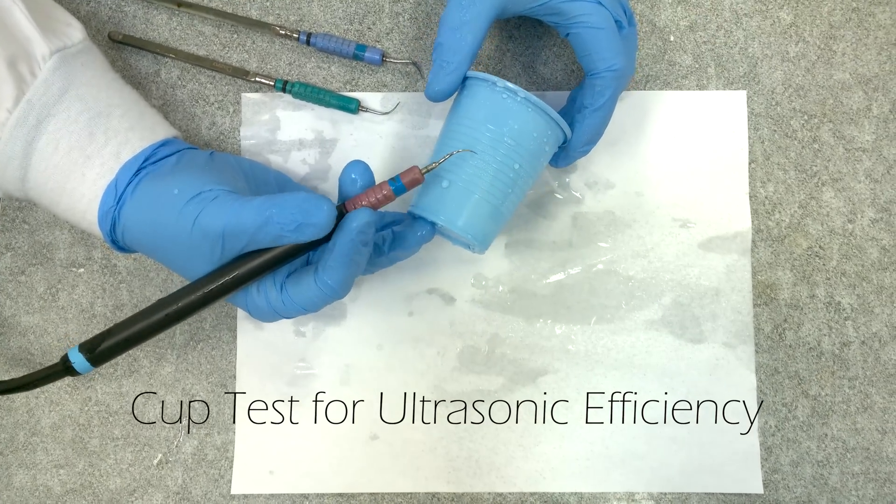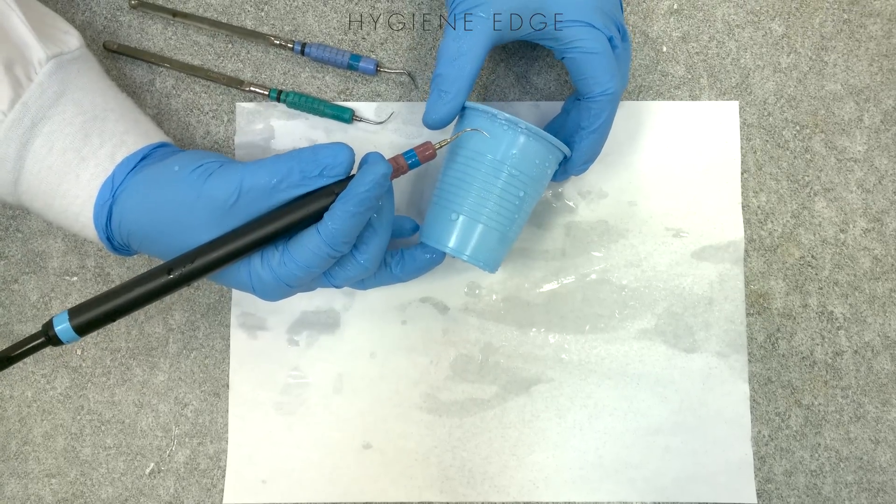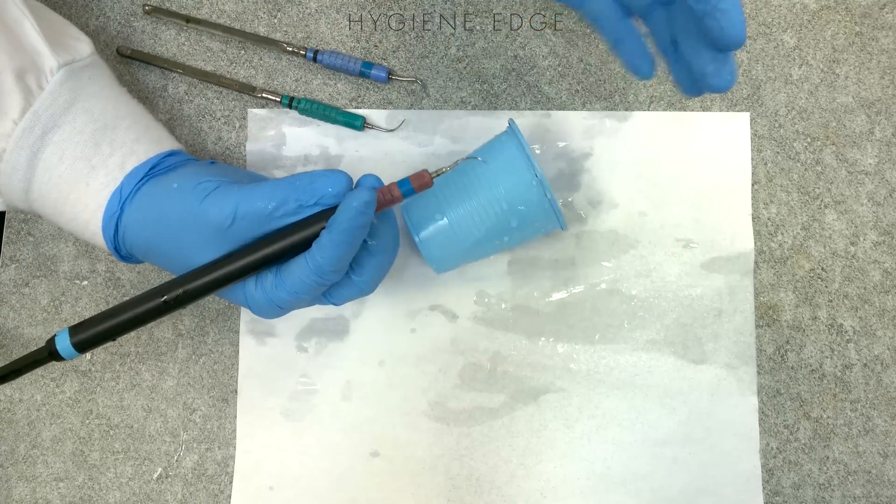This is one quick way to test your ultrasonic tip to see if it's effective for patient use. The best way to test is with your manufacturer's guide — you'll hold it against the paper.